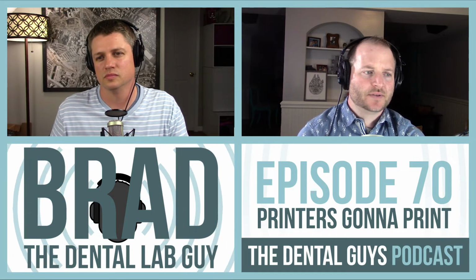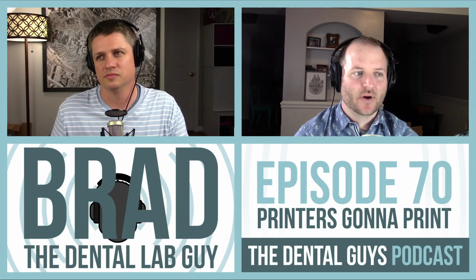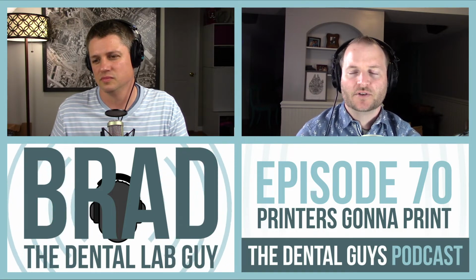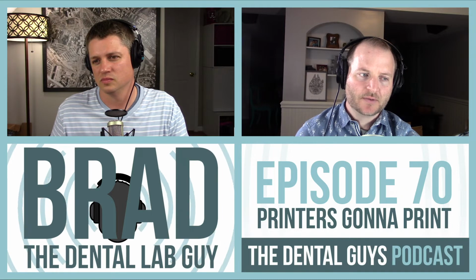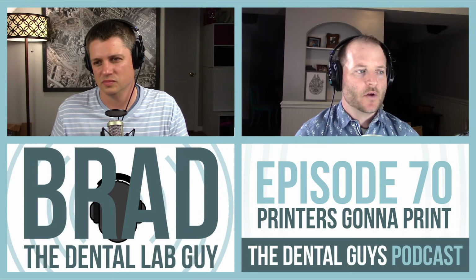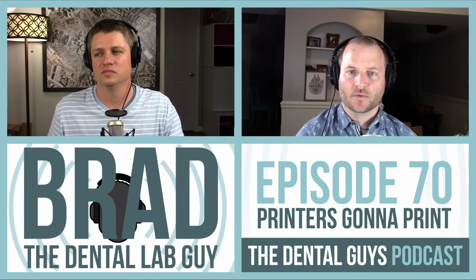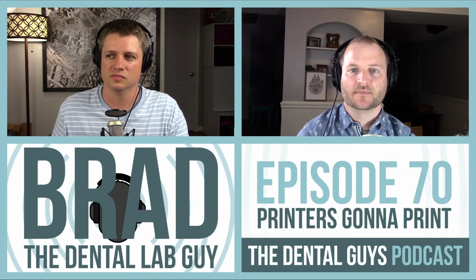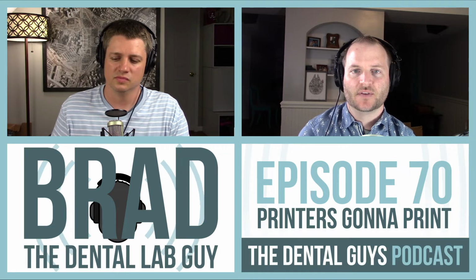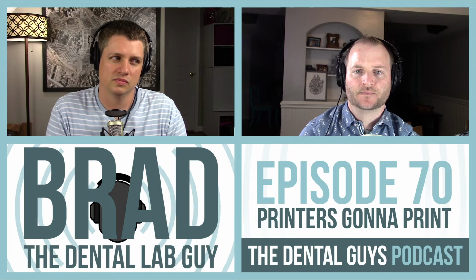Now, from the ones that you've seen or used, and there's a lot of them, we don't want to get into branding so much, just from what you've used, Brad, with these printers, do you think that's pretty much where it stops? Your night guards, aligners, maybe a surgical guide if you're really doing your planning properly and being careful to realize that you're not going to be as accurate. Do you think that's about what's possible at this point? Yeah, I think that sums up the majority.